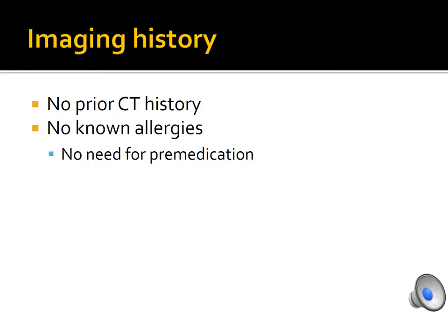Patient has now arrived in our CT department. She is asked about her prior imaging history, if she's had a CT before, and we learn that she has never had any kind of a CT before and has no known drug allergies and no allergies to any iodine or shellfish. Because of this, we know she will not need to be pre-medicated for this CTA. But we will still monitor her for signs and symptoms of any allergic reaction during and following the exam.